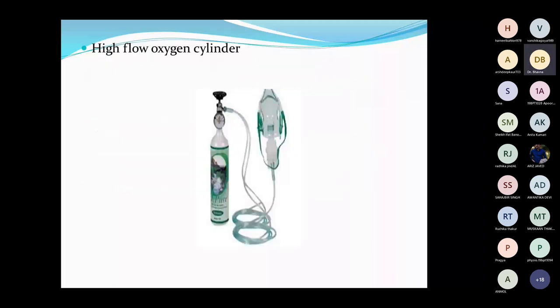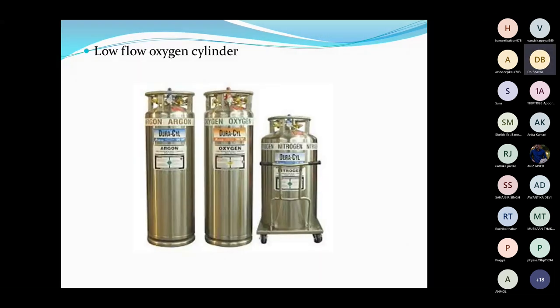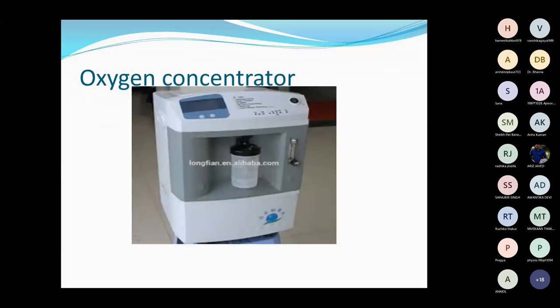So this is a high flow cylinder. This is a low flow oxygen cylinder. And this is a concentrator, where you can see in between a mug type image, this is a reservoir.